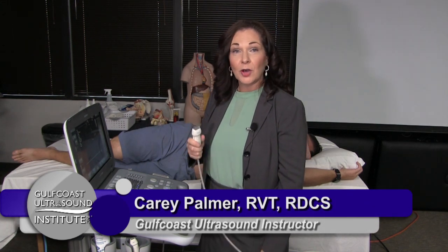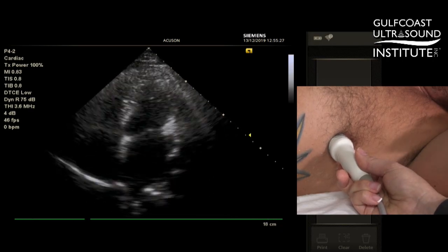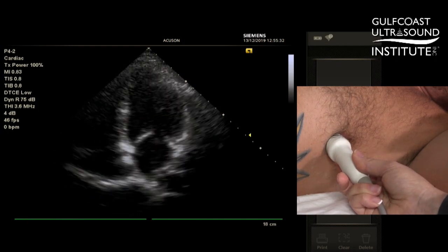Hi, I'm Carrie Palmer from Gulf Coast Ultrasound Institute, and today I'm going to show you a hot tip called dialing in your apical views. I call this tip dialing in your apical views because it's much like tuning into your favorite radio station.